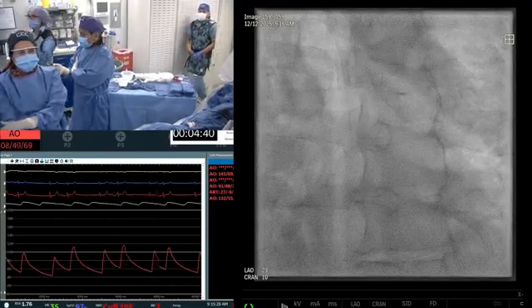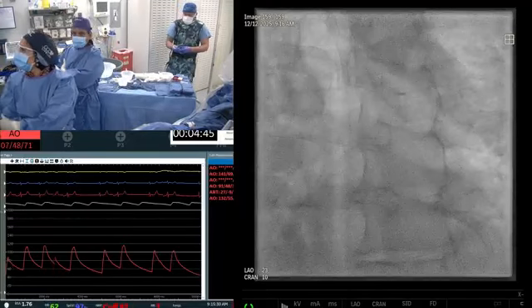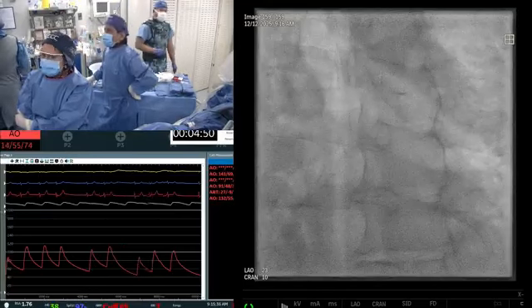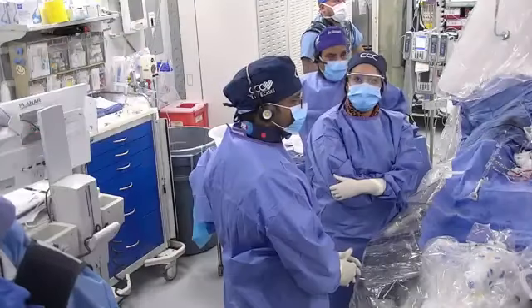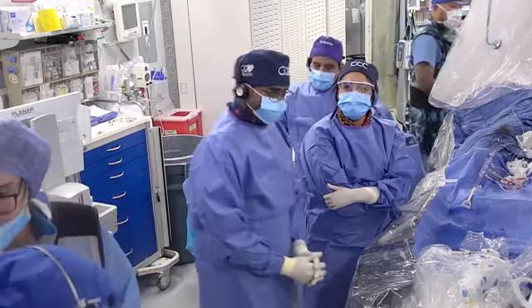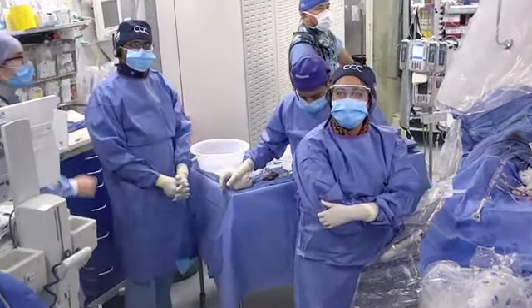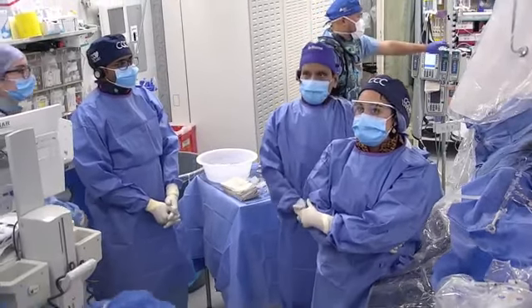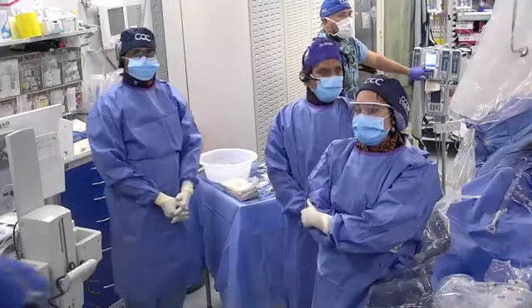We do about 75 atherectomies per month, 60 are rota, about 5-6 are laser, and about 5-6 are orbital. Orbital numbers have gone down actually, sometimes even 1 or 2. The laser is basically for uncrossable lesions and unexpanded stents. For unexpanded stents, laser is a great device, although we use rota also, but excimer laser is a very good device for that. Orbital does not work there, IVL can work, but laser is our first line treatment. And there you can actually use the dye. You don't need to do a saline flush.